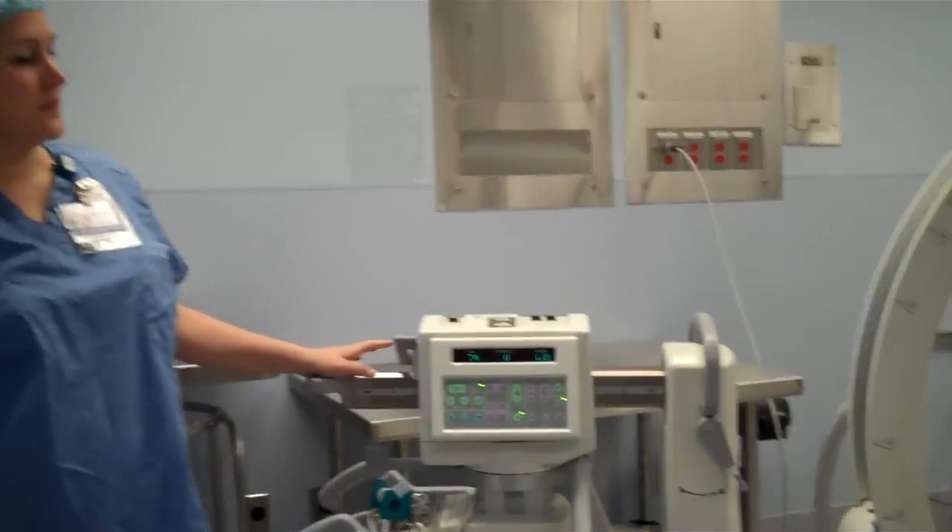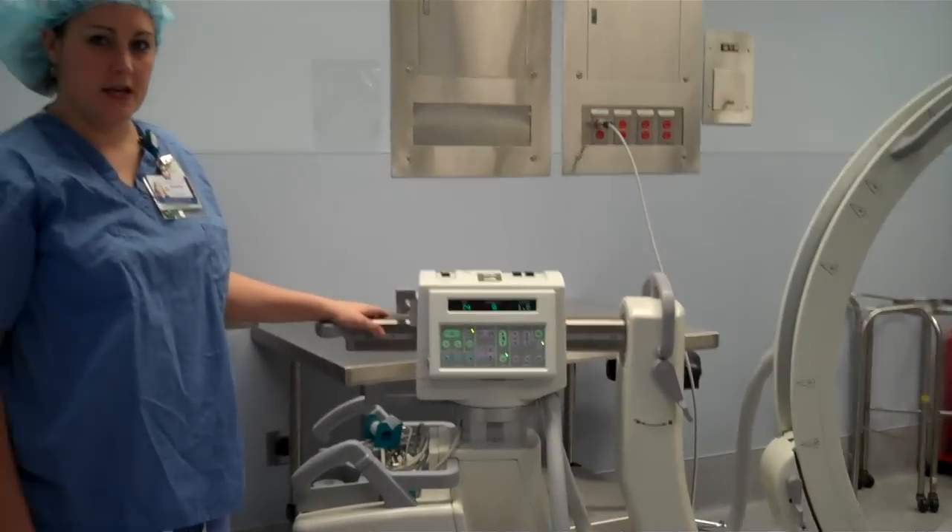Those are the locks. Once you know the function of the locks and how you can move your C-arm, you can do almost any case.